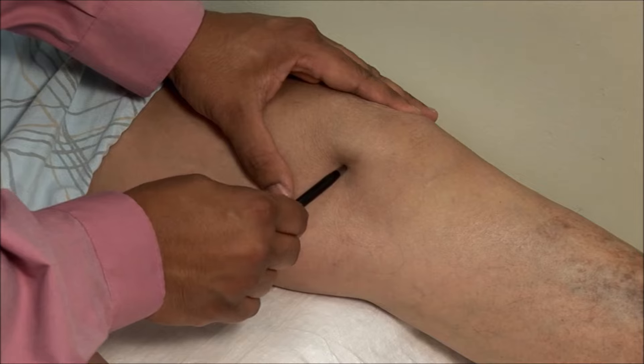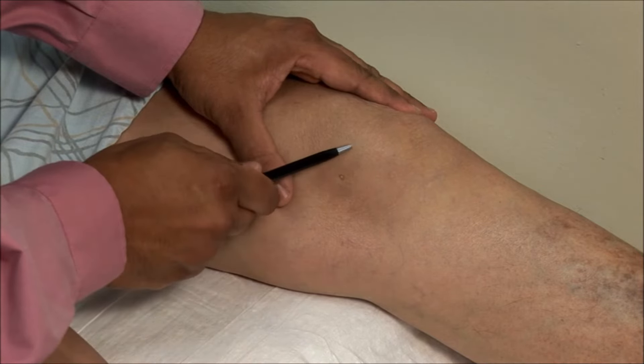The most common mistake is going too high and bouncing the needle off the underside of the patella.